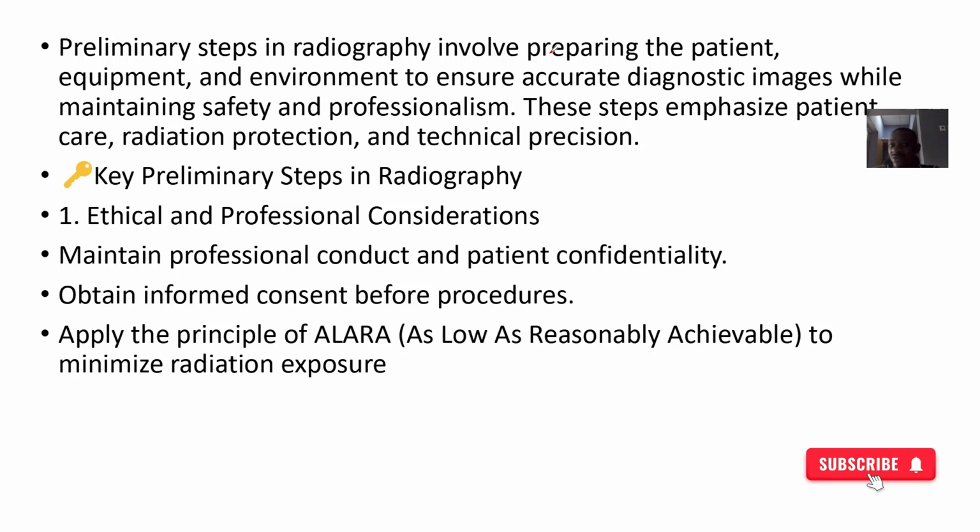It involves preparing the patients, making sure that all the equipment is intact, and making sure that the environment is nice. You understand all those kinds of things. So the key preliminary steps in radiography start with ethical and professional considerations. You have to maintain professional conduct and patient confidentiality. You have to obtain permission for everything you are doing. You apply the ALARA principle, that is, as low as reasonably achievable.